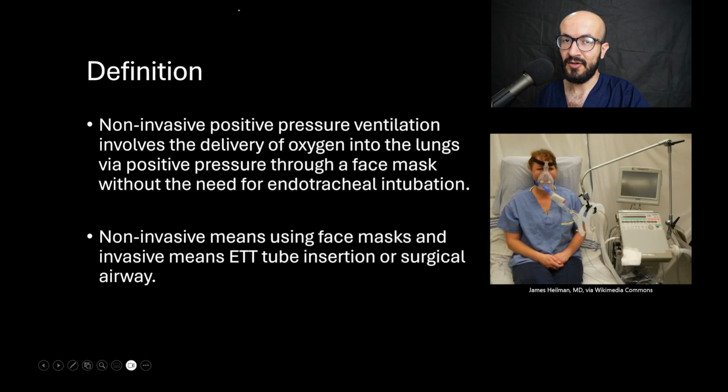So continuing our discussion about airway management, after we talked about the bedside assessment of the airway and the modalities of airway management, now we are going to talk about positive pressure ventilation.